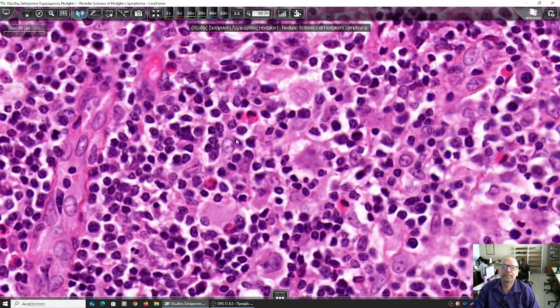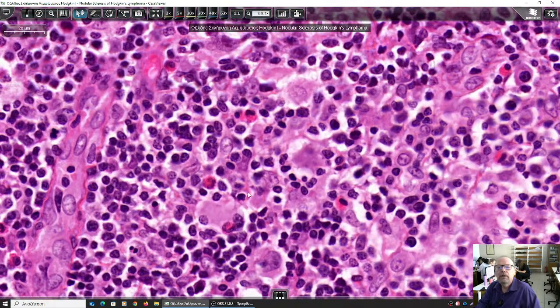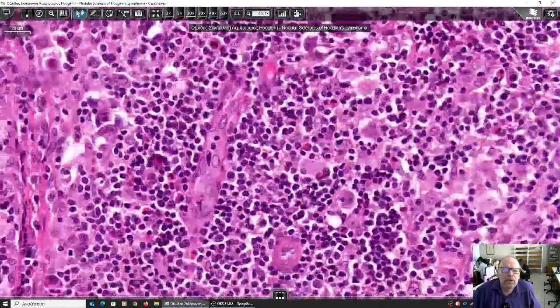Have a look. Of course, these are eosinophils. They have lobulated nuclei. Look, you see they are lobulated? However, they are not neutrophils, because the cytoplasm is too red to be neutrophils. So these are eosinophils. What are they doing there, the eosinophils among the lacunar giant cells?